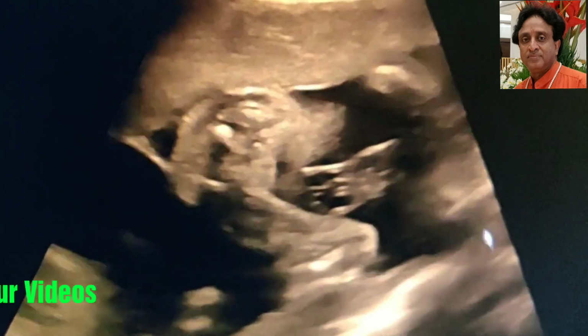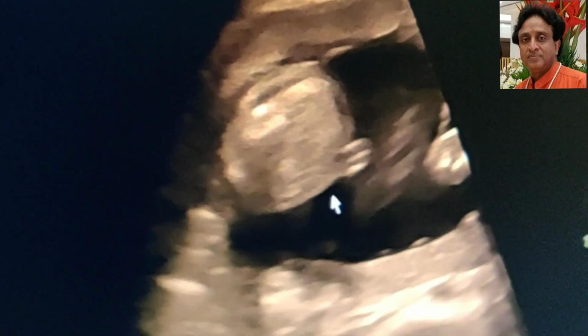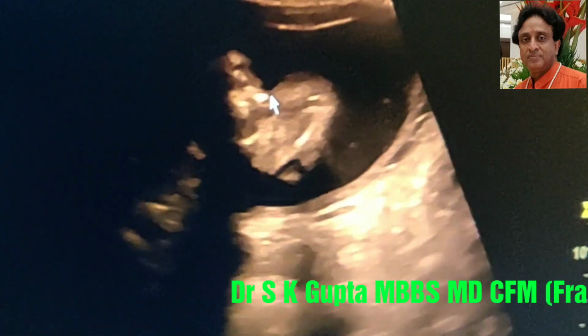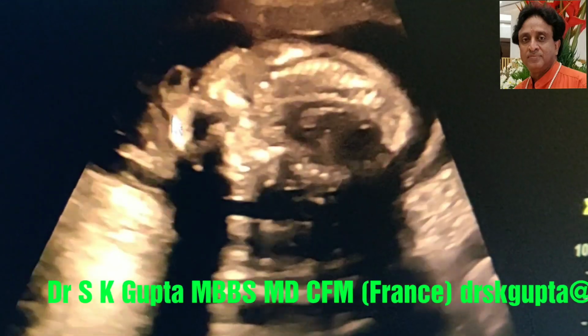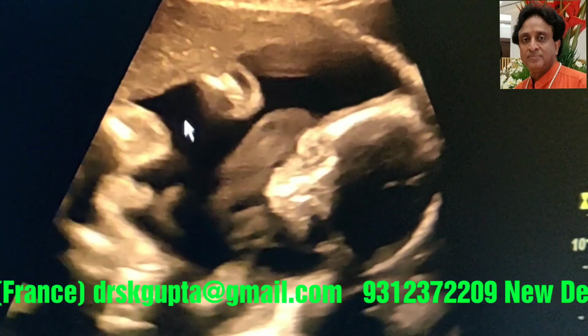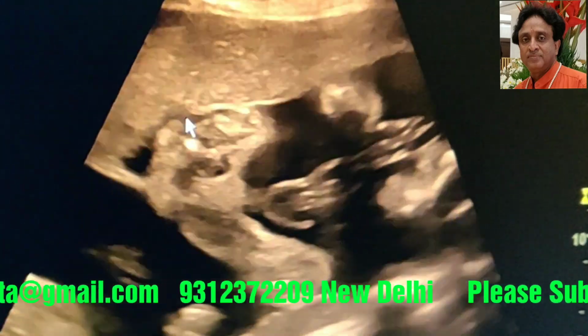This is one twin you can see, and this is the intertwin membrane, and this is the other twin where you can see the abdomen, and this is the anencephalic area. You can see the brain hanging from the spinal cord. We are going to show you this in detail.